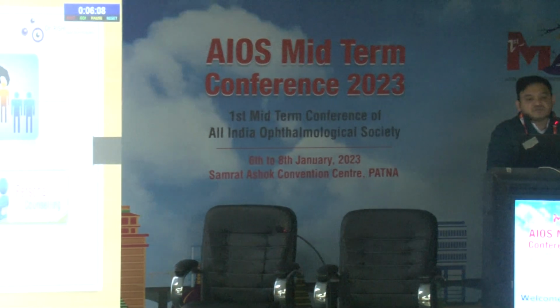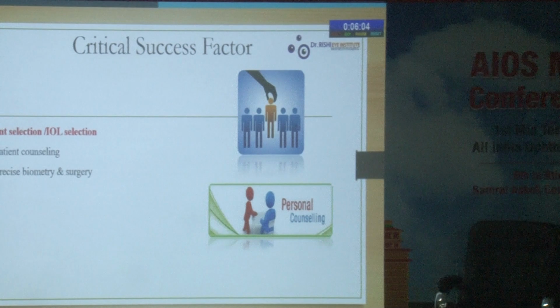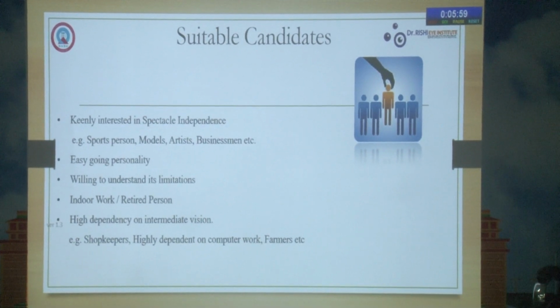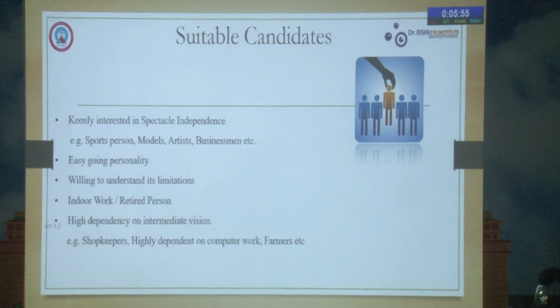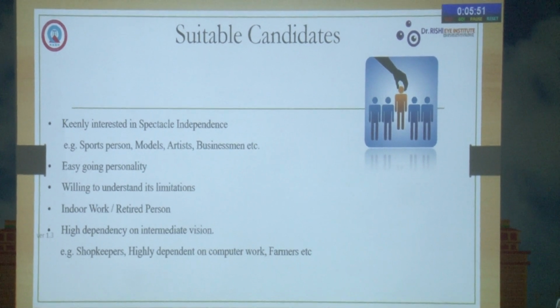The critical success factors for these IOLs are patient counseling, precise biometry, and proper surgery. Suitable candidates are keenly interested in spectacle independence, have an easygoing personality, are willing to understand limitations, do indoor work, and are highly dependent on intermediate vision.